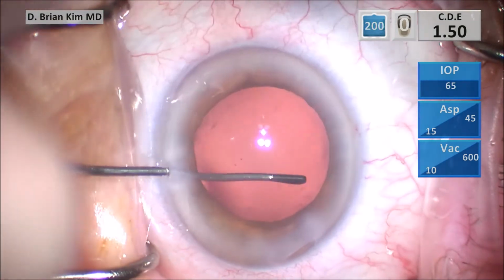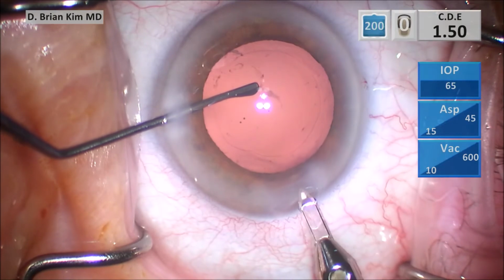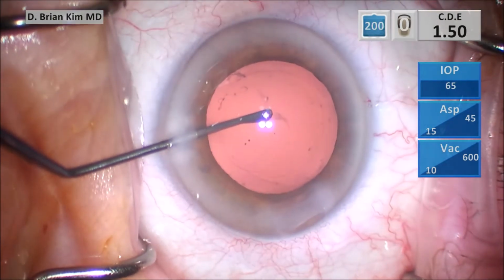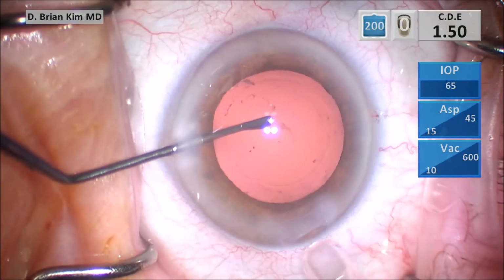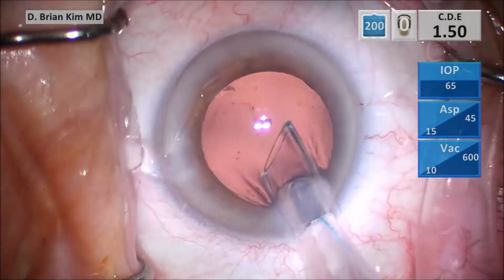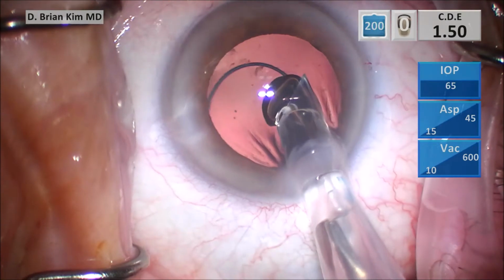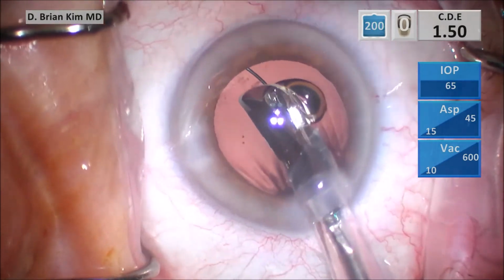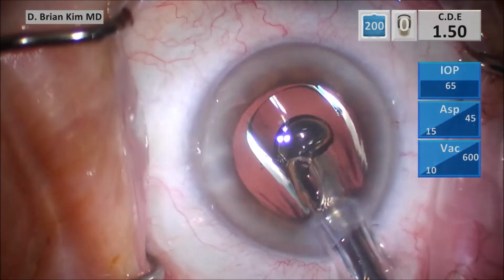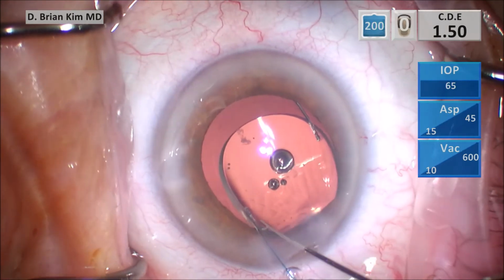With these dense lenses, I prefer to put a 3-piece lens because I do think there might be some zonulopathy in these situations, and if there's late dislocation, I can lasso some suture around a 3-piece haptics. So I go ahead and widen the incision. I go in with the 3-piece lens with the bevel pointed to the left. I deliver the leading haptic into the bag pointed to the left. Rotate my wrist counterclockwise so the optic comes out flat. Make sure the trailing haptic comes out pointing to the right, outside the eye. Dial in the trailing haptic with the Malyugin.